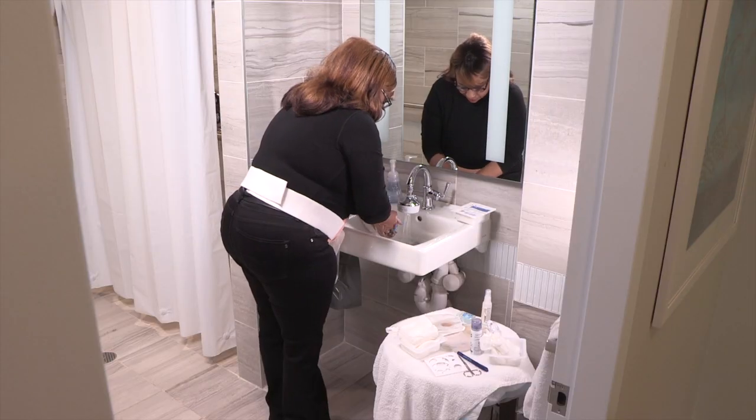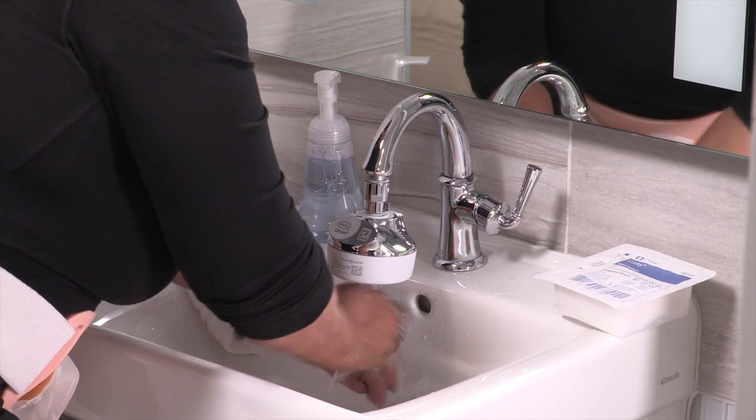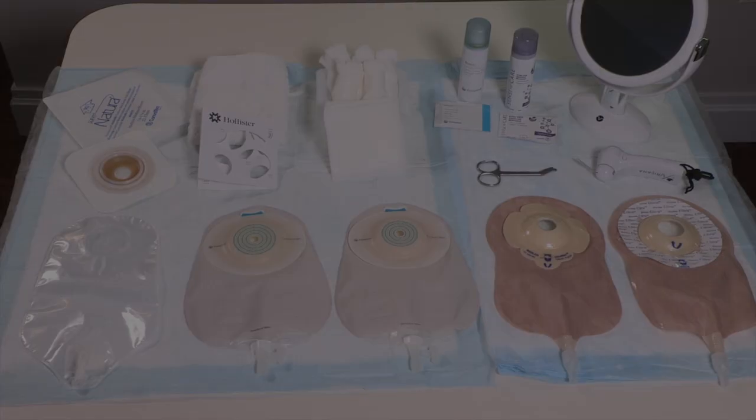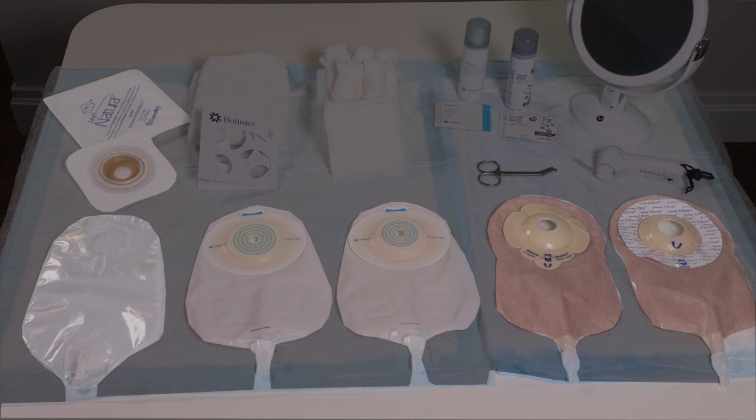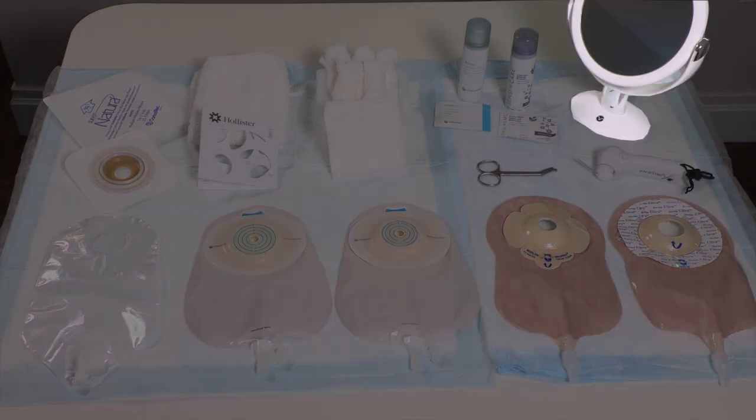Before you start, wash your hands with soap and water or use an alcohol-based hand sanitizer. Then gather your supplies. You'll need adhesive remover spray, gauze, paper towels or a clean washcloth, a measuring guide, scissors if you're using a cut-to-fit wafer, and a new pouching system. You may also want a blow dryer or hand-held fan, and a small mirror.